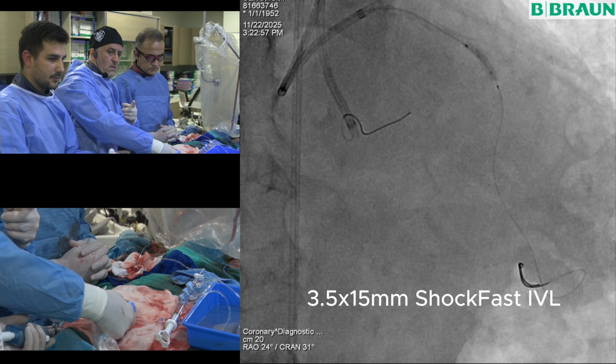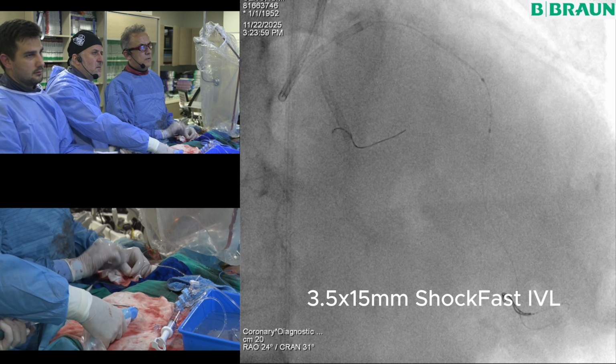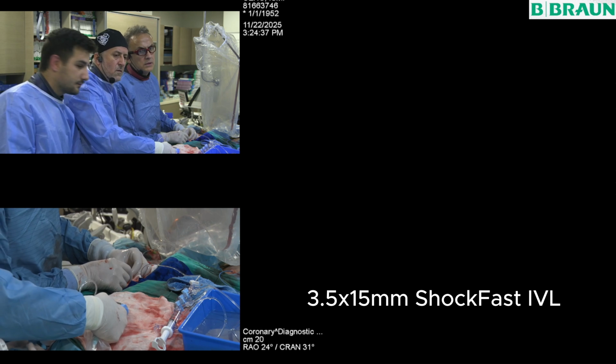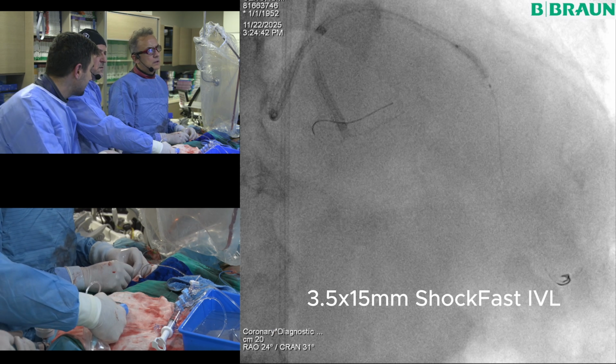Yeah. This is exactly a case for why we should use intravascular imaging. We know from a lot of data that an FFR of 0.8 or above epicardial is not ischemic, and less than 0.8 probably is. That's in a proximal vessel. This is quite a long way down a pretty tatty small LAD.